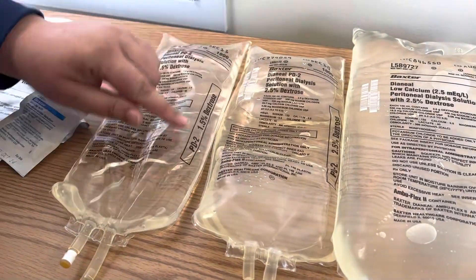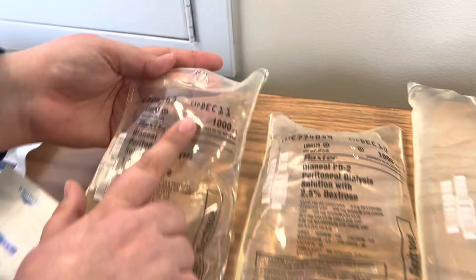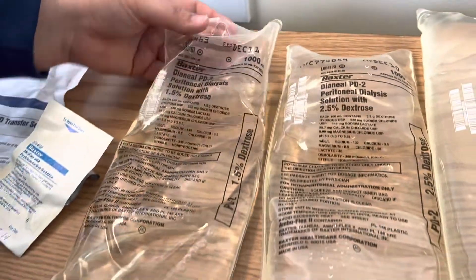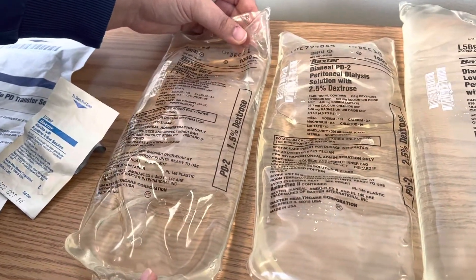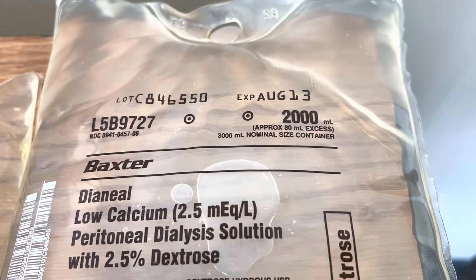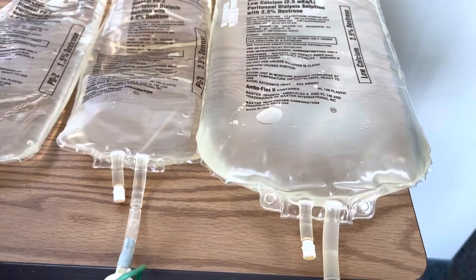So SEAL stands for solution. E is expiration date, which should be on the top of your solution. A is amount — your provider should be ordering a specific amount of dialysis solution that we're instilling. This is a 1,000 ml bag but typically it's usually a little bit more, so always double-check how much you're going to be instilling.